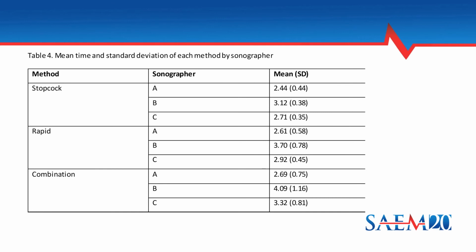Finally, the times obtained by each of the three sonographers for the three techniques were compared. Sonographer A was an emergency medicine resident, and sonographers B and C were attending emergency physicians. There was variation amongst the sonographers, but the stopcock technique was the most rapid for each.